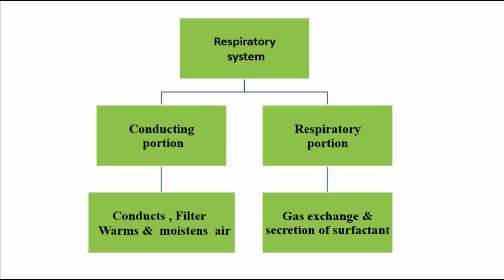Now, the respiratory system is made up of the conducting portion and the respiratory portion. The function of the conducting portion is to conduct or filter and warm and moisturize air. But the respiratory portion is where gaseous exchange and secretion of the surfactant takes place.